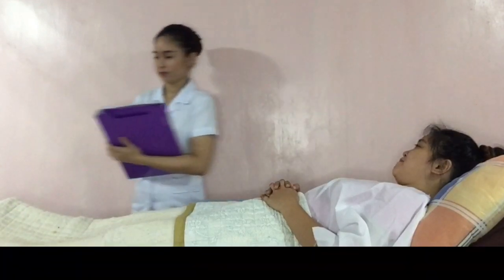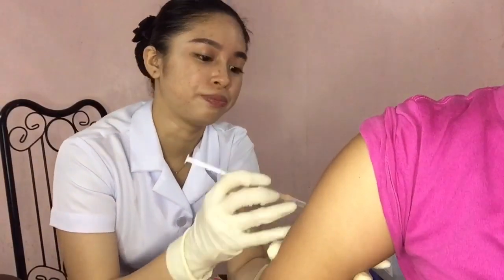Okay. So now let's determine which site we'll use. Inspect the area for bruising, inflammation, and edema. Palpate the site to avoid any area that is tender. To make sure that you have the right size of needle, use your thumb and forefinger to grasp a skin fold of tissue at the injection site. Measure the fold from top to bottom and check that the needle is about half as long.